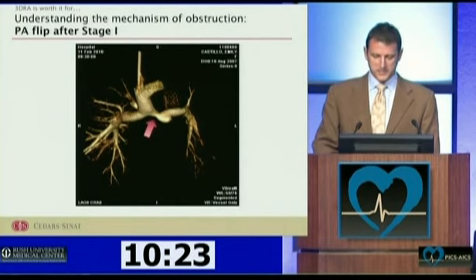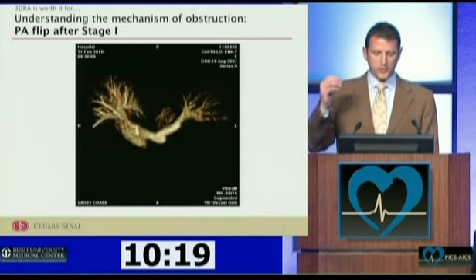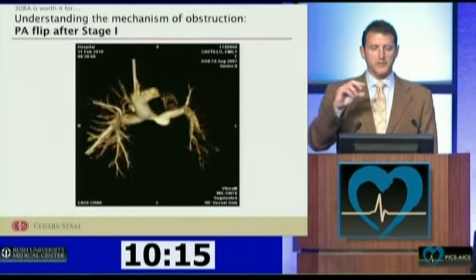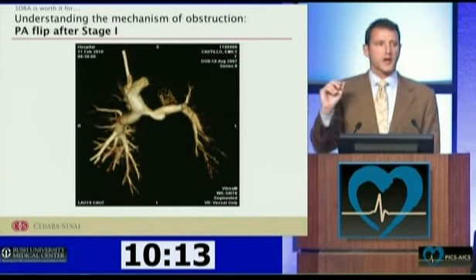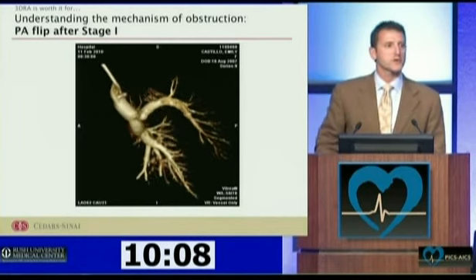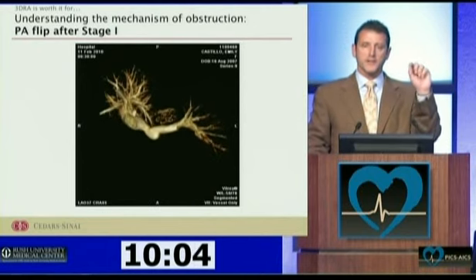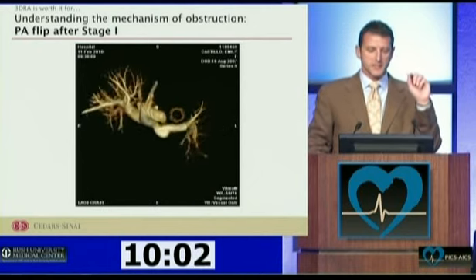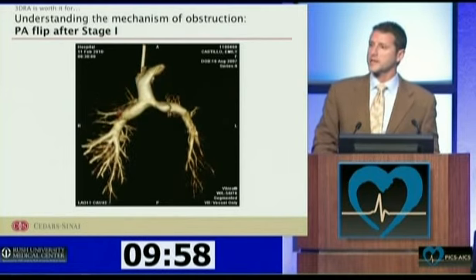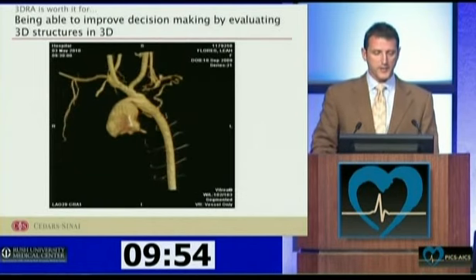with that stenosis. Well, as we begin to look at this, and we kept seeing this over and over again, this is a patient who had a Norwood palliation, we kept seeing what appeared to be the PA stump being flipped up. It's just flipped up. And we had an extensive conversation with our surgeons about, boy, we think we're seeing this a lot because isn't there a way to tack that down? Again, it's something we can't appreciate as well on 2D or at all, but we think this will change the way that our surgeons complete this operation once they've ligated the pulmonary artery.